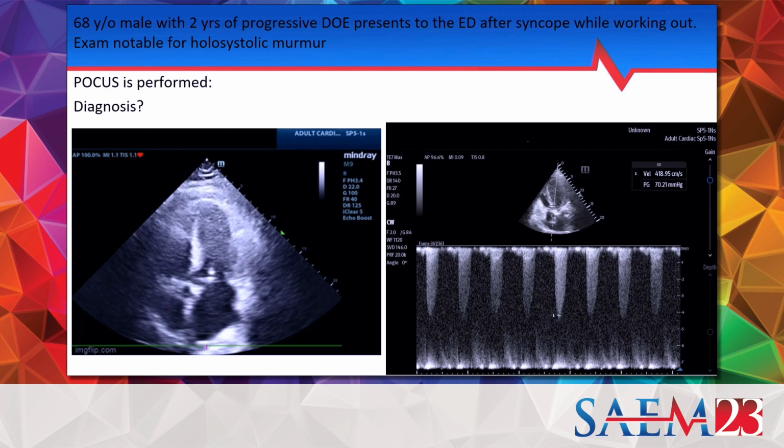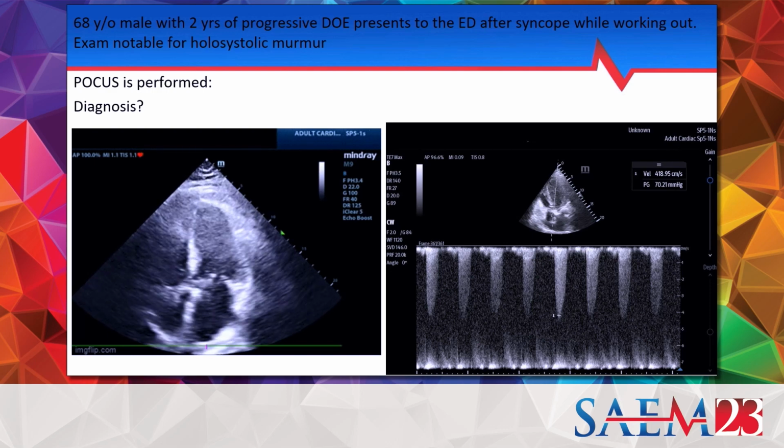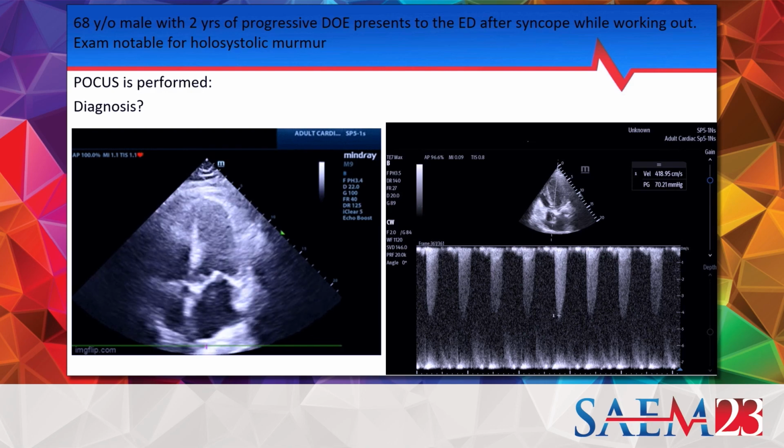So I'm going to take from the audience here. What do you guys think? Are you seeing anything abnormal here? And if so, what do you think the diagnosis is?